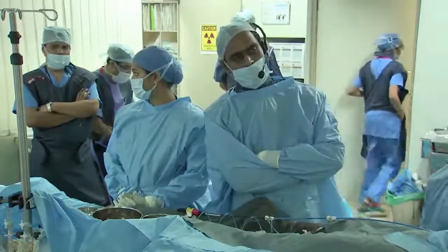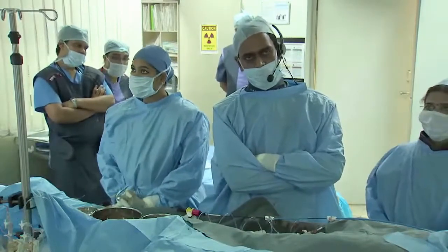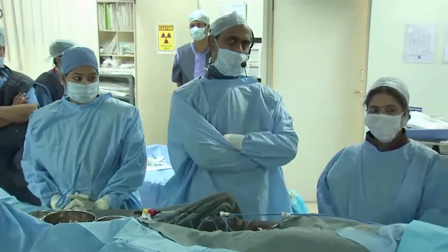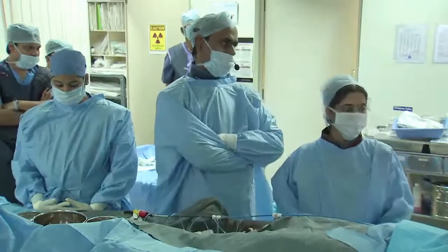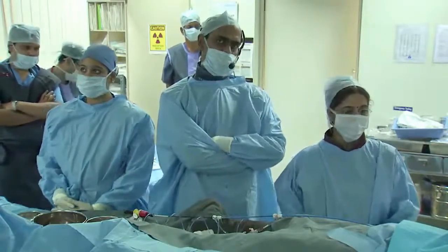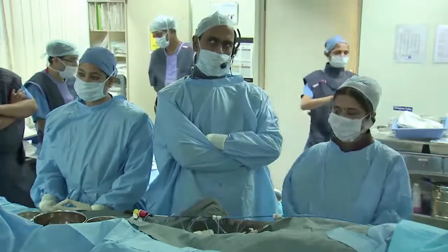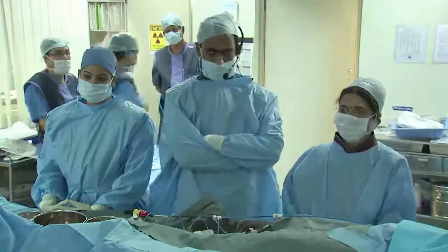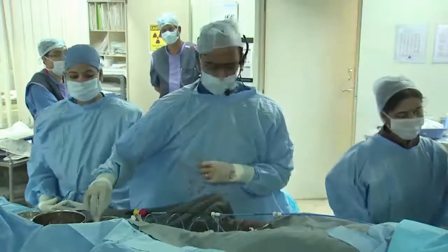As it was pointed out to you earlier, he's already on 2 pulmonary vasodilators, sildenafil, bosentan, and warfarin. So I don't want to make it too small, a fenestration. Any other comments from the audience here? Here's something down here, yes, front left.